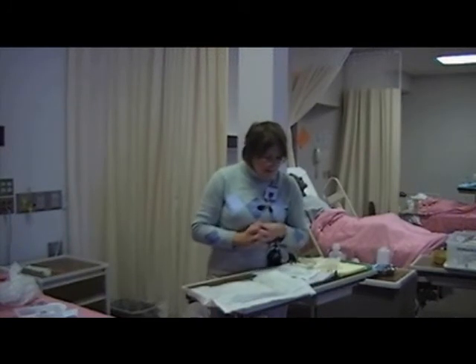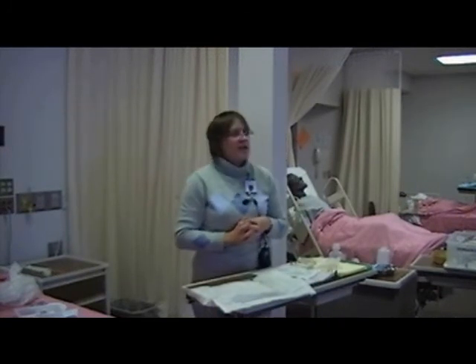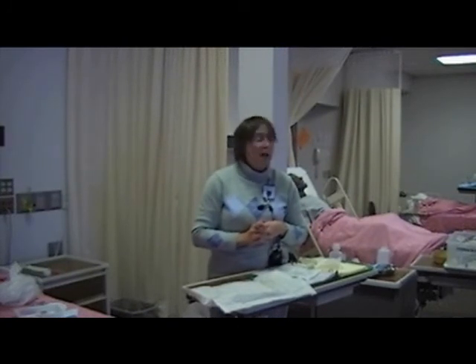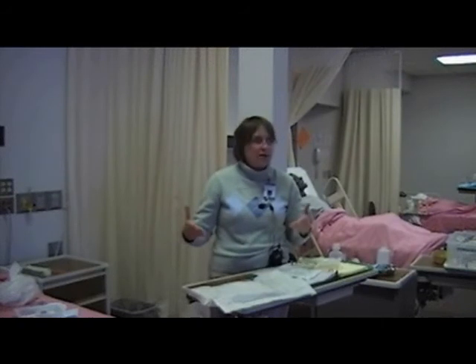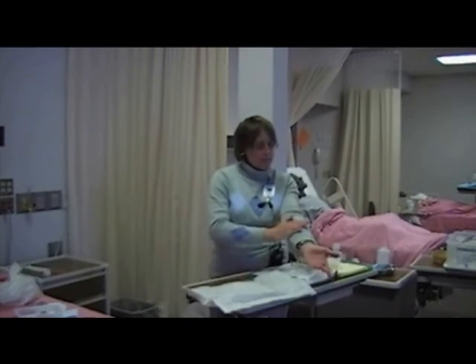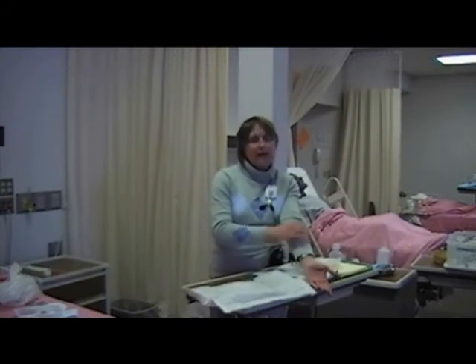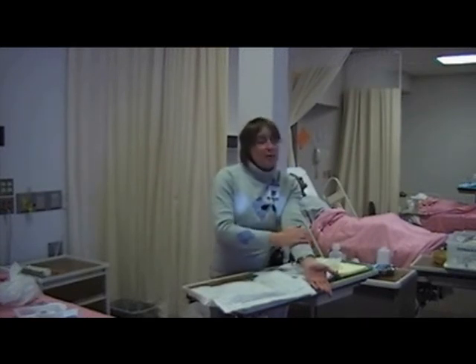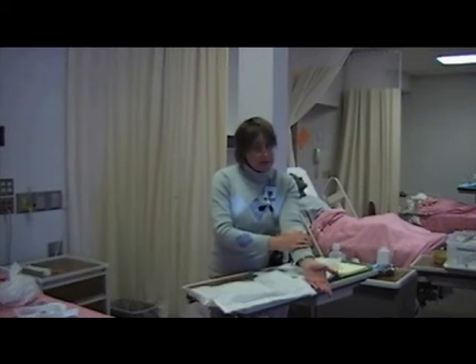Now, if a securement device is used, how often should this be changed? Now, the securement device is something you would most often see on a PICC line. Sutures are sutured in. A securement device is what I had mentioned where you might see like a hard plastic thing with sticky tape on it, holds it in place. You should change that securement device with each dressing change. So if they do have one that is not sutured, you would be changing that securement device at the same time.